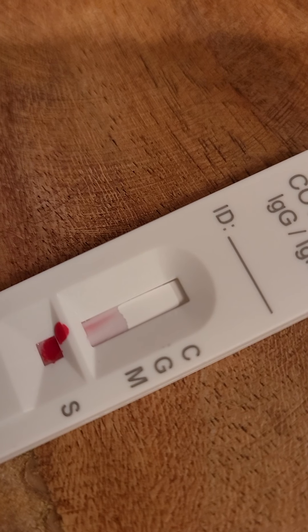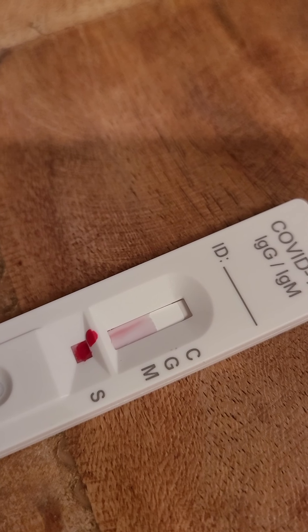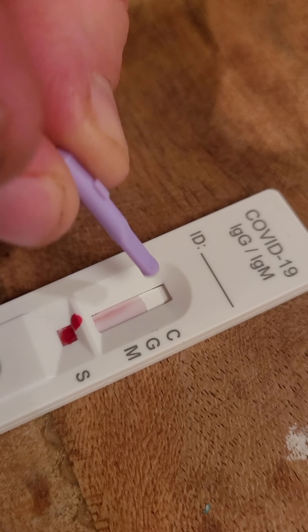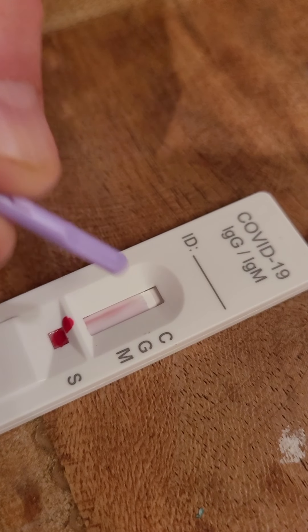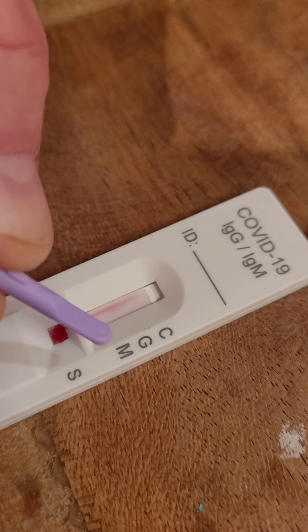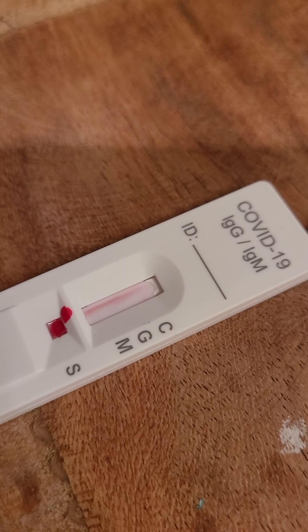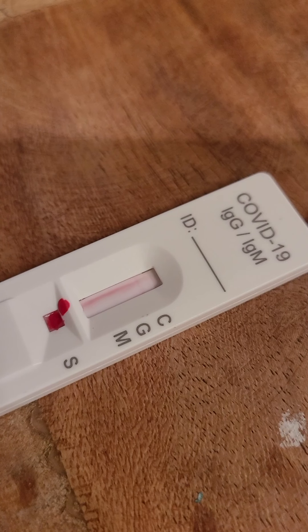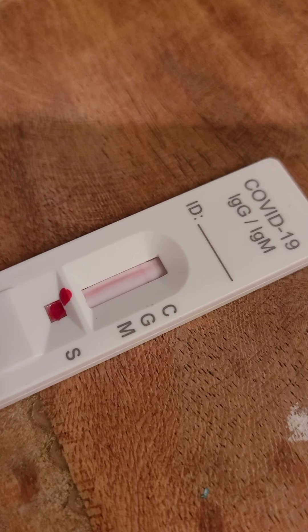Watch that, see? I should pause it. Wait - explain what C means. C is the control, it has to have a C. There are no lines right now but you'll see a line there. The G means you have the antibody, and the M means you have corona. You should see that line coming in - it's just starting to come in.